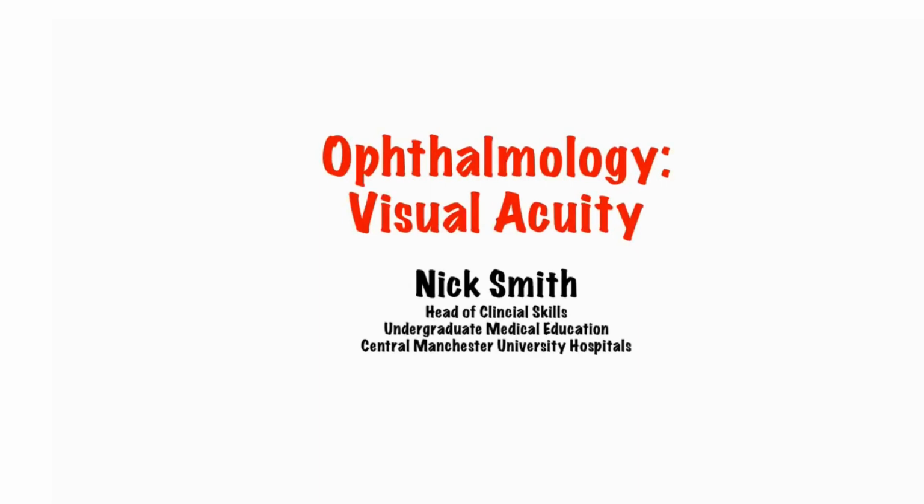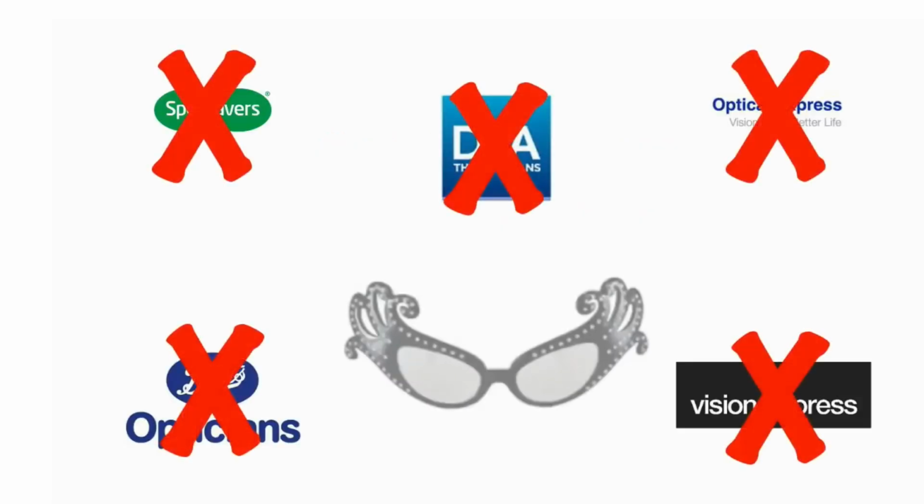Nick, and this short video is about the basics of testing visual acuity, or VAs. It's not the test you get at the opticians, so corrective lenses, glasses or contact lenses should be worn.